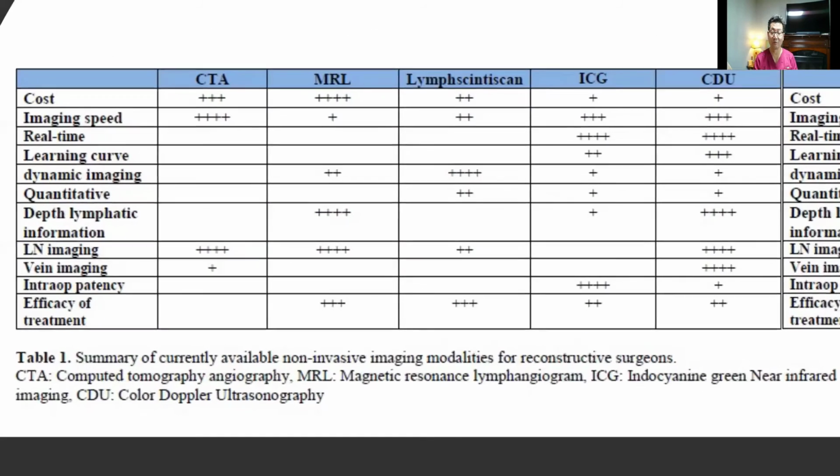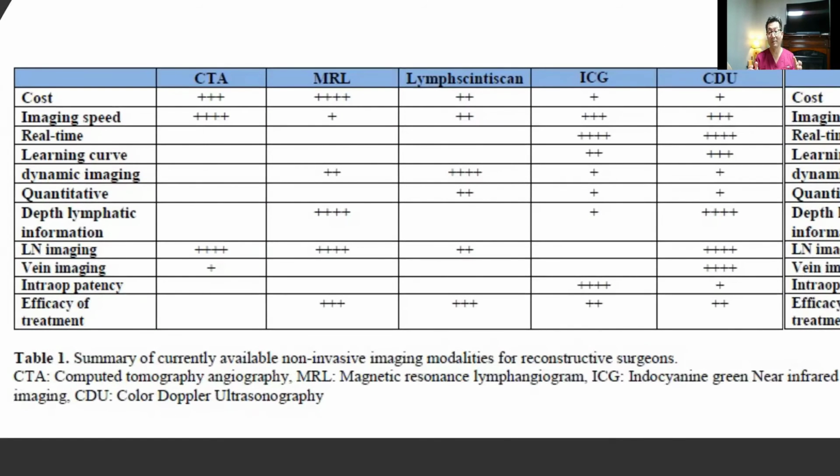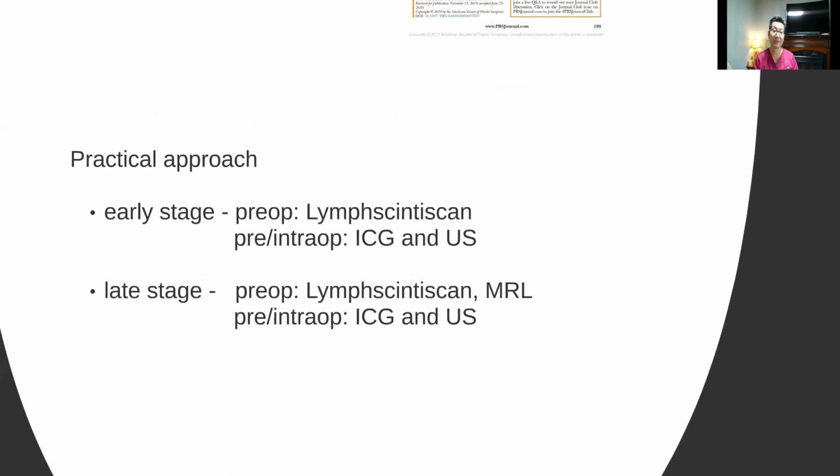increasing the efficiency overall. So again, going back to this overall description of the multiple imaging modalities, I do believe that the ultrasound is the best value for your money. Of course, ICG is simpler and easier, but in a little bit more advanced cases, along with identifying the vein, I think the ultrasound is just much, much better.